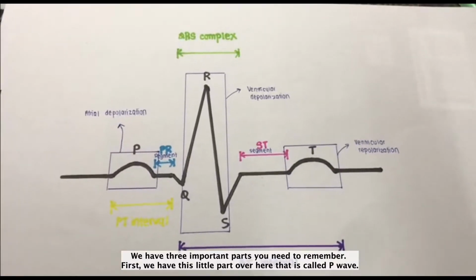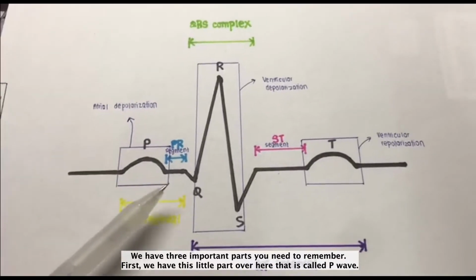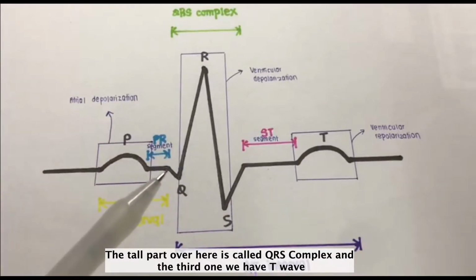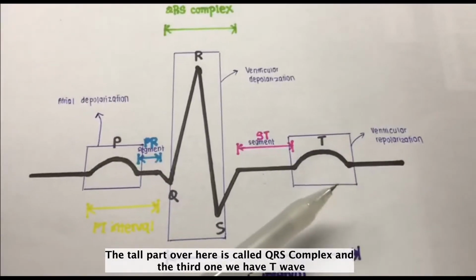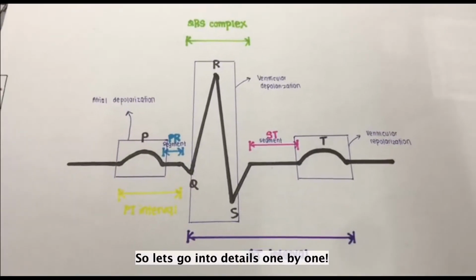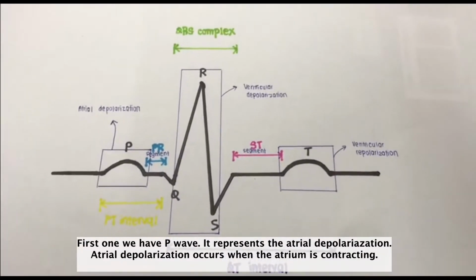So we have three important parts you need to remember. First up, we have this little part over here called the P wave, and then the tall part over here is called the QRS complex, and then the third one, again this little part over here, is called the T wave. So let us go in detail one by one.